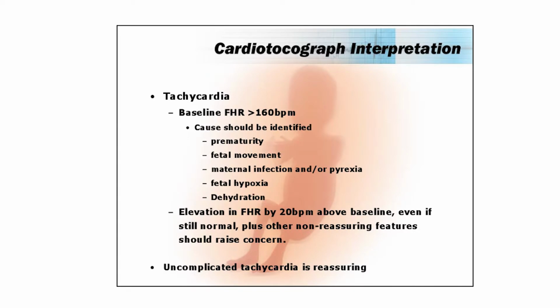And by the way, Indonesia is no different to the rest of the world. All we can do throughout the world, if we use CTGs on preterm infants, is our best. There is no golden textbook saying this is how you should interpret CTGs and take decisions on severely preterm infants. One of the most difficult decisions in maternity care, I think, and in some countries this happens, where CTGs are performed on babies as young, fetuses, as early as 28 weeks gestation, for example, or even earlier.